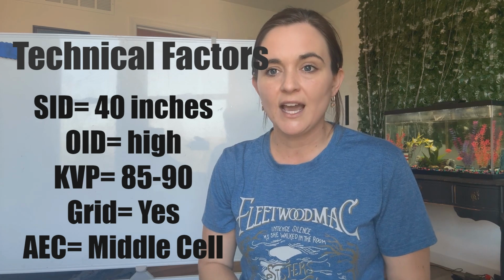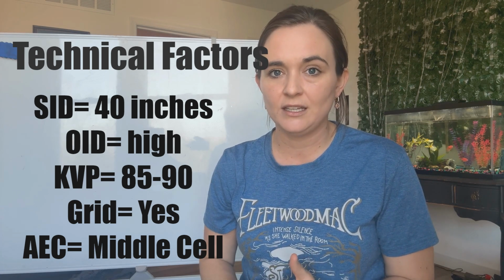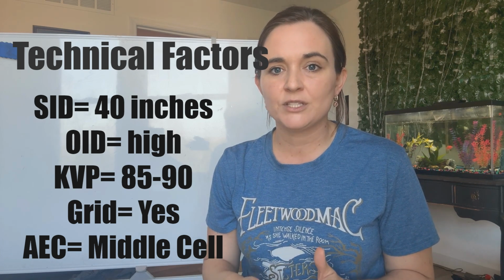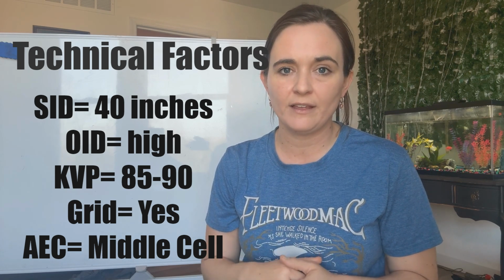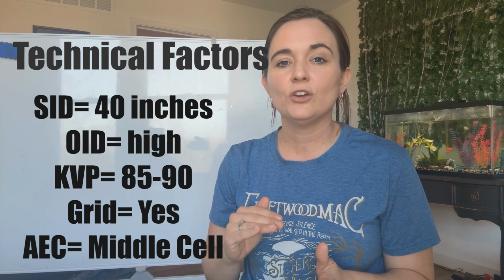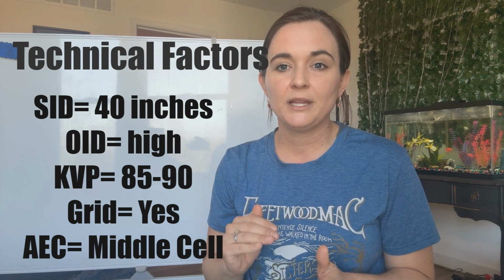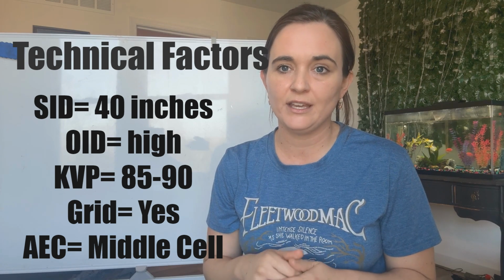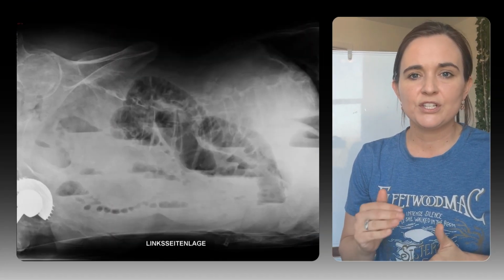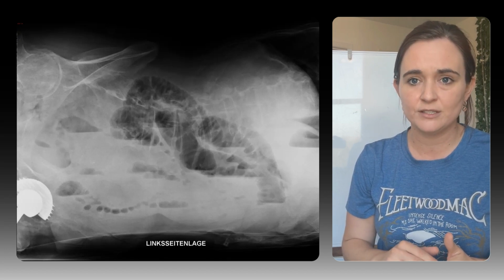Your OID is higher here, so we bump the kVp to 85 to 90. Always use your grid. Your horizontal beam is going to be centered 2 inches above the iliac crest. On expiration again, and then you're going to label this as LLD. Place your side markers clearly and look for a crescent of free air above the liver. We're looking for stacked air fluid levels in this image, sharp diaphragm edges.